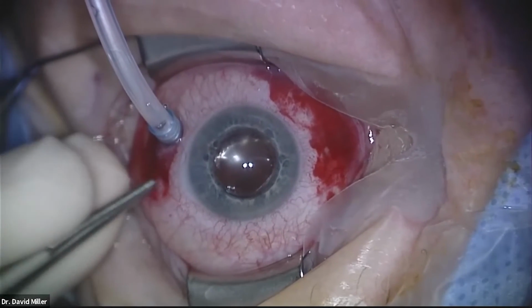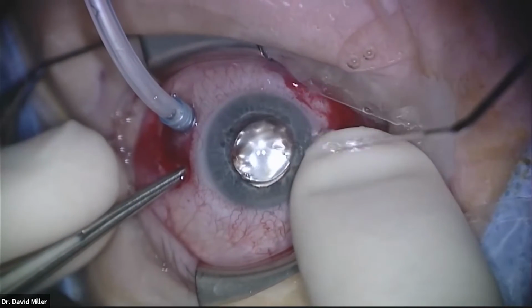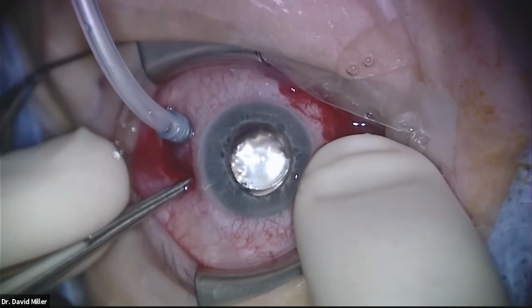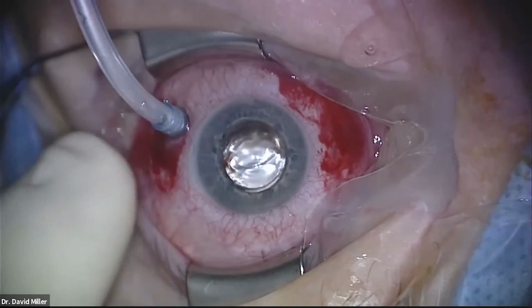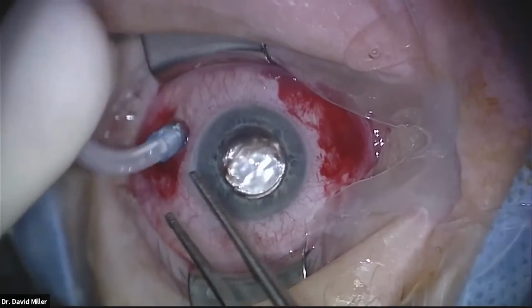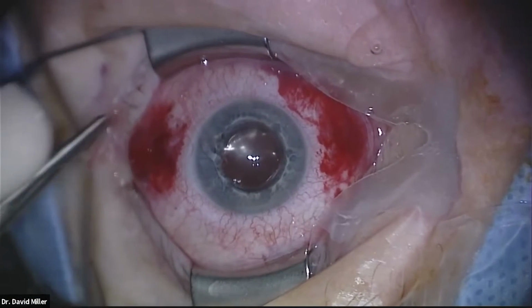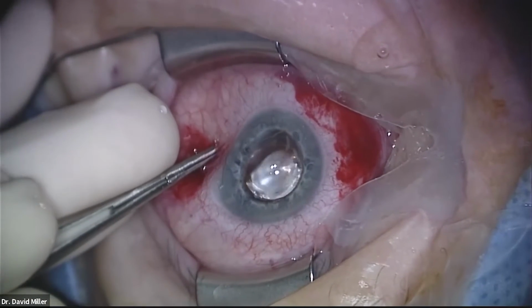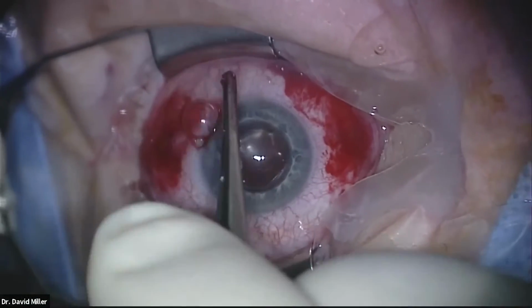And so this hole's here, the conjunctiva can be displaced again. Go ahead and pump the eye up a little bit. I'll press against that pressure he's putting on the eye. Very good. I can kind of feel that with my finger. We're in pretty good shape. We're going to pull out the infusion cannula next. And of course, we lost quite a bit of gas there. So we're going to reinflate the eye with the same solution.